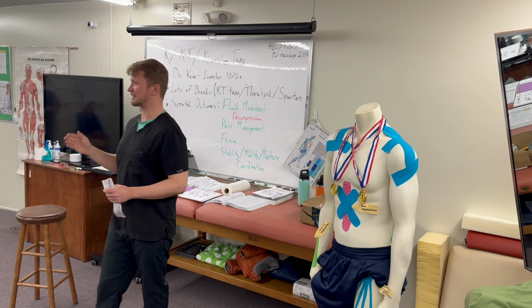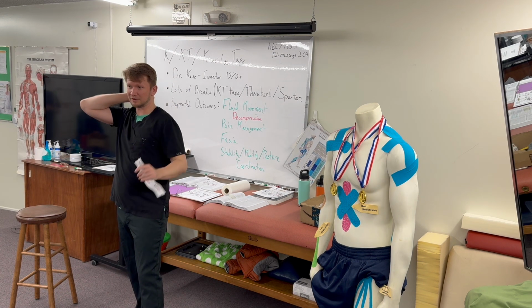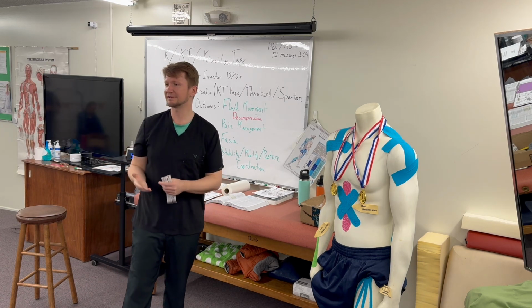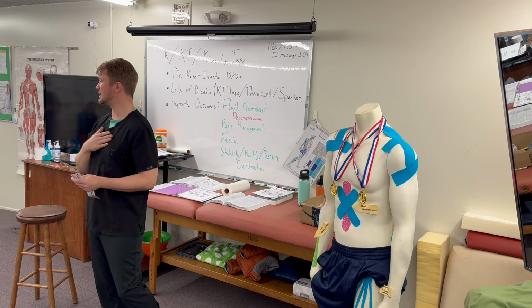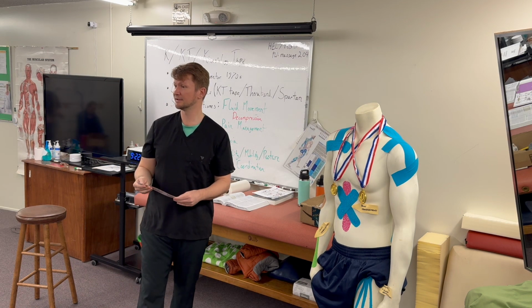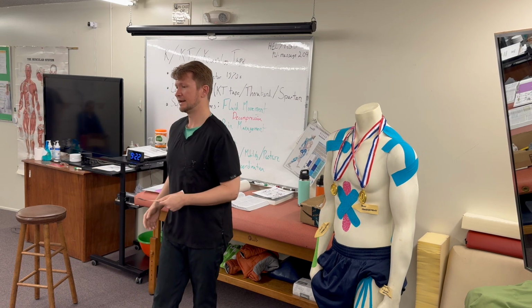But that would only really make sense if I have a nice sheen with no hair to worry about. And so this lower neck hair, taping around the neck, that ends up being probably my biggest complication in taping for the neck, but there's hair in the way. So body hair, it's a factor.